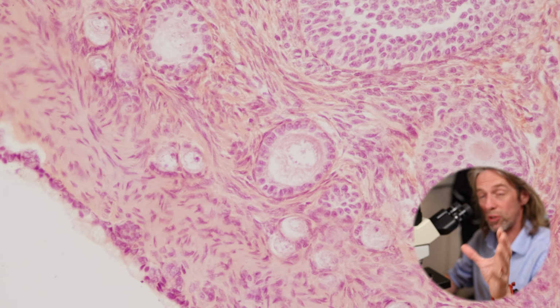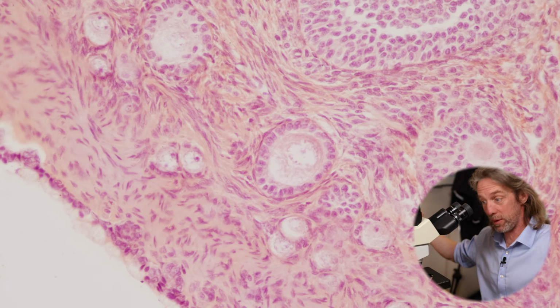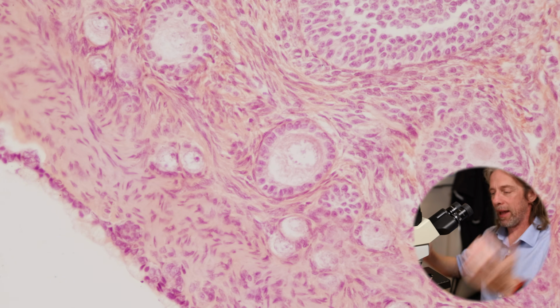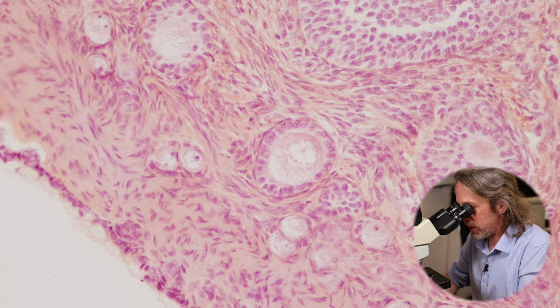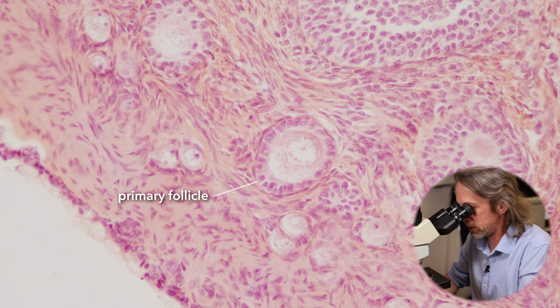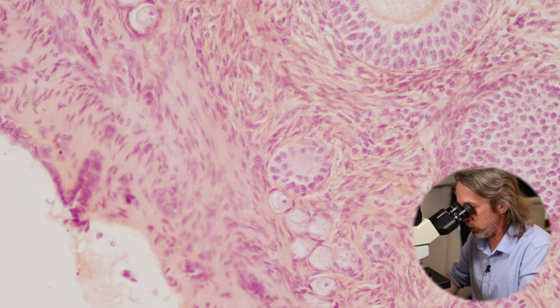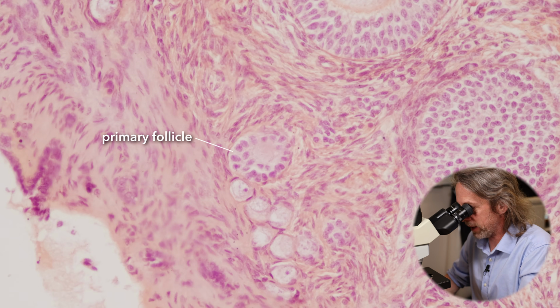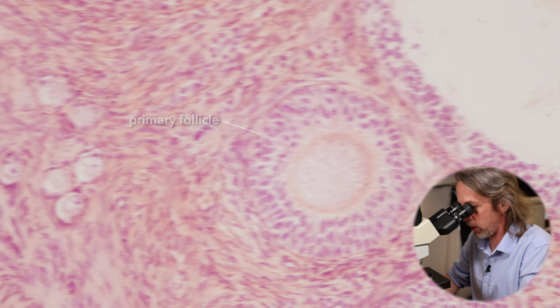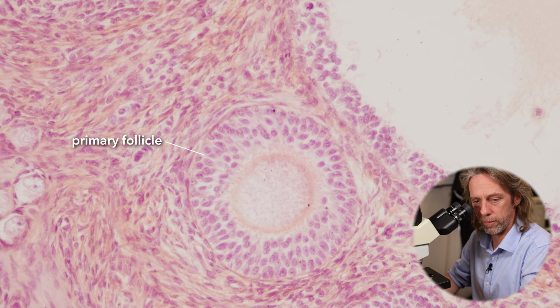The follicular cells are also going to have receptors for follicle stimulating hormone, FSH. The follicle stimulating hormone is stimulating the cells of the follicle and stimulating this growth. So we see that the first part of the primary follicle is that, where we start to get a single layer of cuboidal cells. And we can see some other follicles that are maybe a little bit further along with 2 layers of cuboidal cells. And as we go up here, this is a slightly more developed primary follicle.